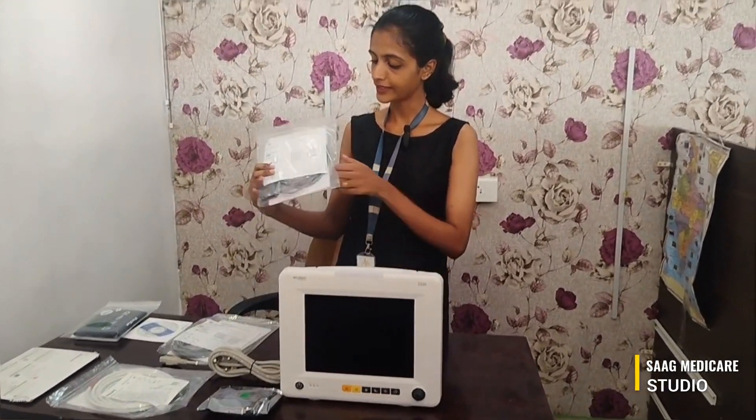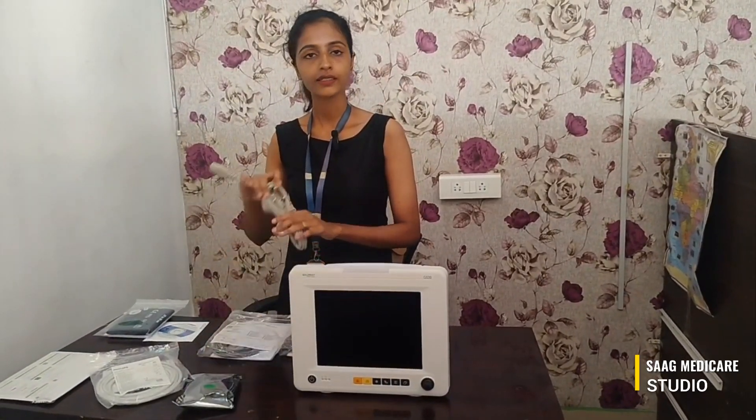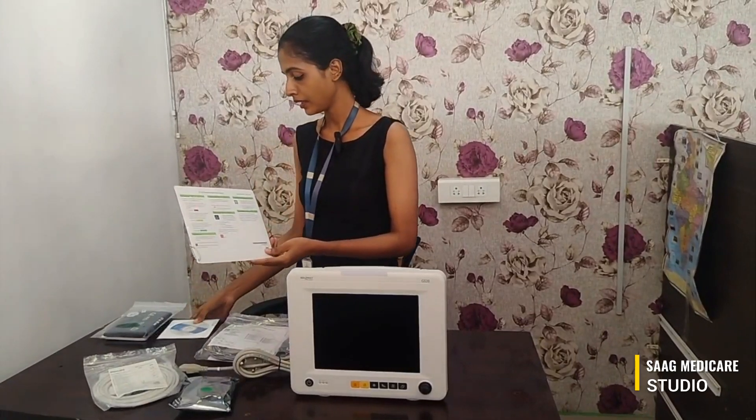These are the accessories coming with the machine. We can see one ECG cable, ECG leads, NIBP cuffs, NIBP air hose, and an SpO2 block. We can also see a power cable, a manual, and an instruction guide. We will also see how to install the battery.